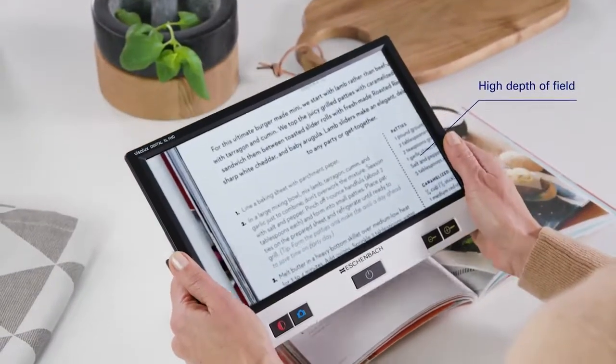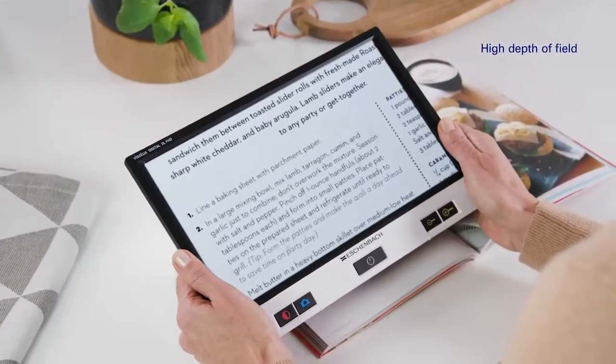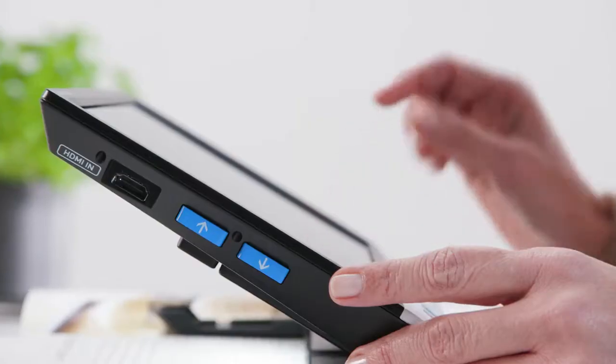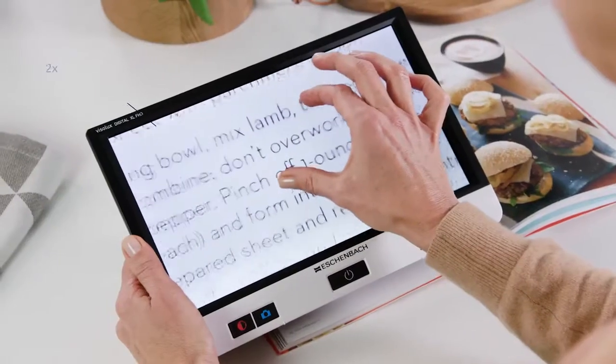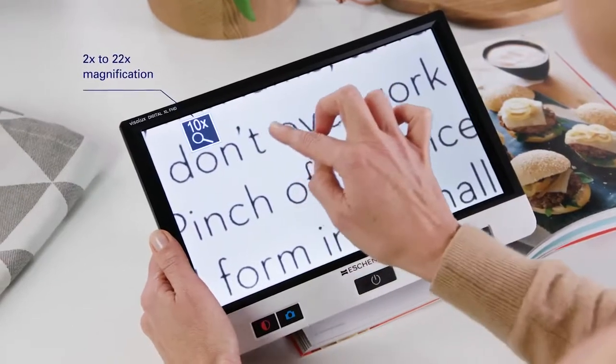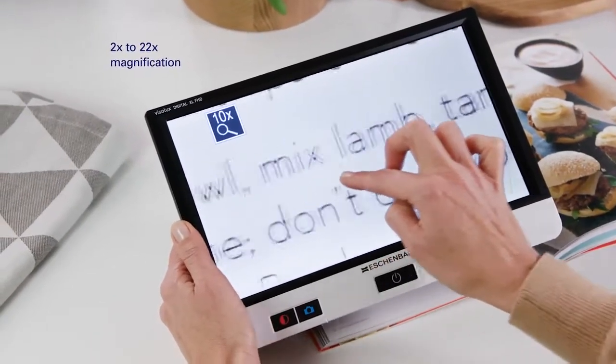The high depth of field allows variable use distances. Thus, text and image always remain sharp. It also has 2 to 22 times magnification.